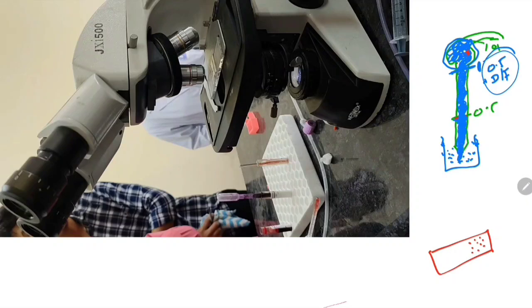So how will you calculate the dilution factor in this pipette? This final marking is 101. So 101 is the final marking minus 1. Why minus 1? Because this part up to this part only carries diluting fluid, no blood is there, so we have to minus that part. So the final volume will be 100, and the initial volume was 0.5 blood. Remember, 0.5 was blood.